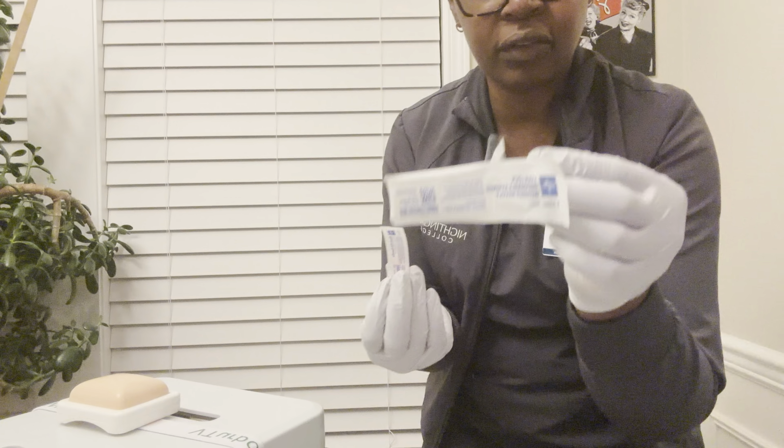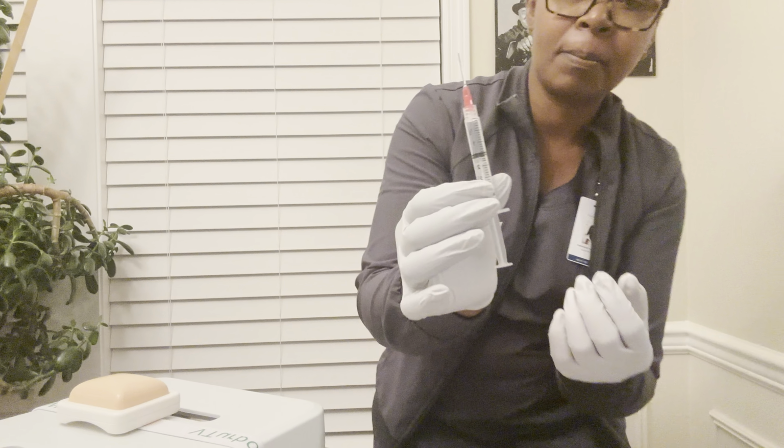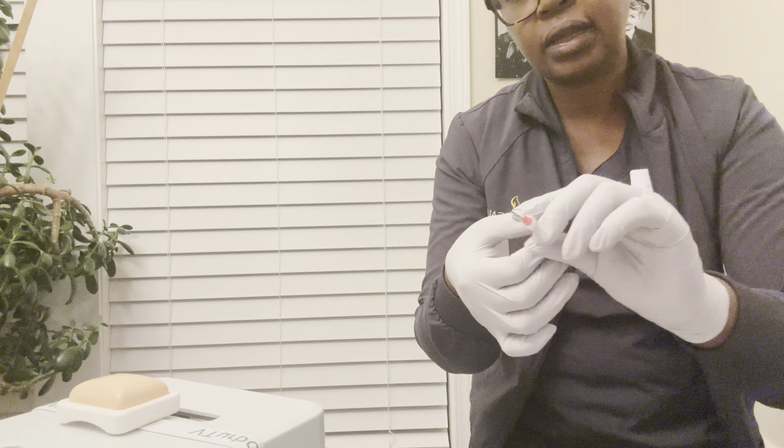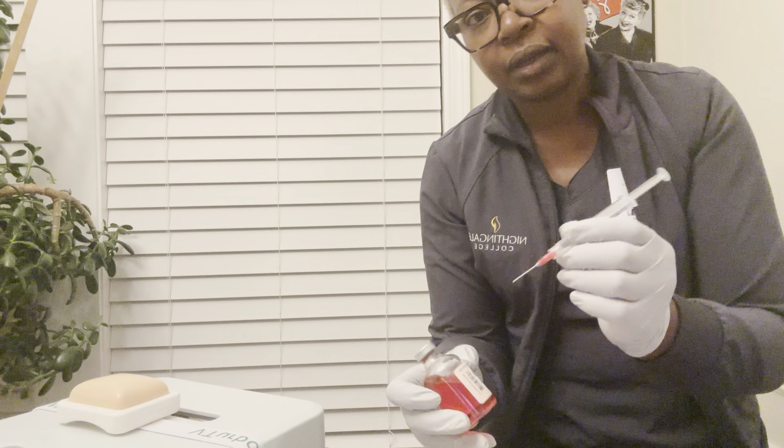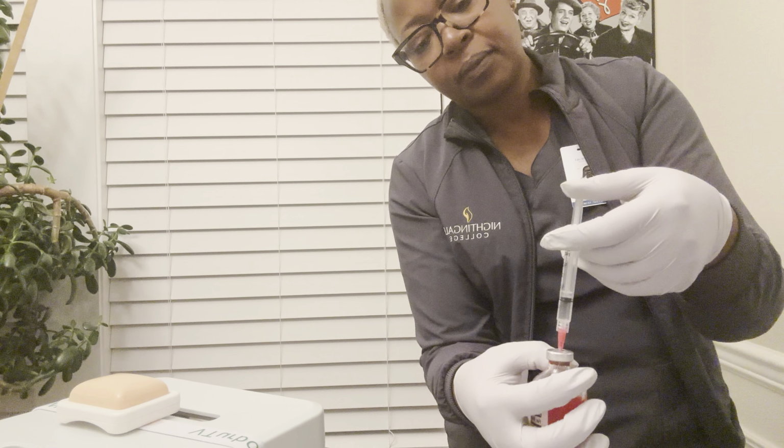I will draw 1.5 ml of air. I'll then go ahead and at an angle of 45 degrees with my bevel up, I will hit the bull's eye, and I'll go to 90 degrees. I will inject the air.